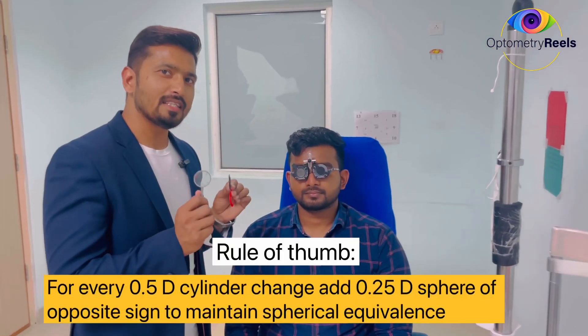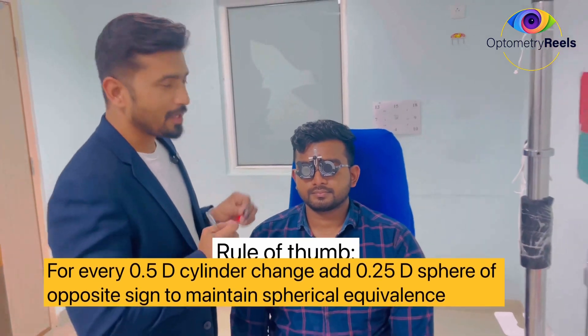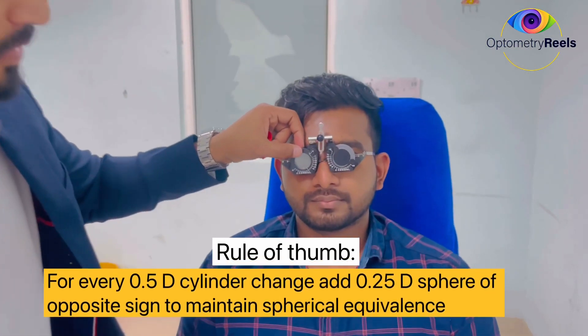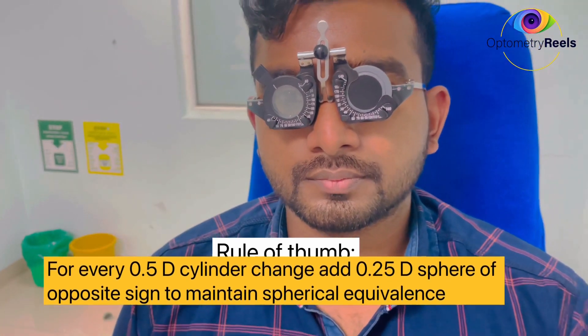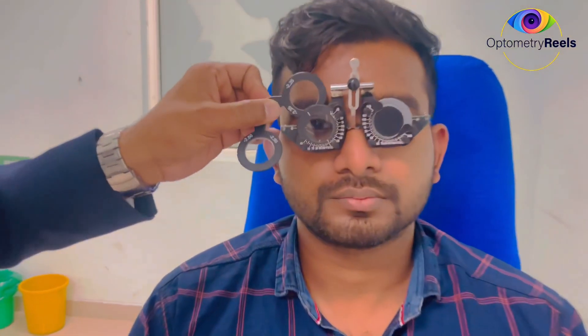Friends, remember one very important thing about the JCC: whenever you refine the power and make a change of 0.5 diopter, you have to make an adjustment to the sphere also. From 1.75 we made 2.25 — a change of 0.5 diopter — so we have to add 0.25 to the sphere to maintain the spherical equivalent, changing the sphere from 2.5 to 2.25.